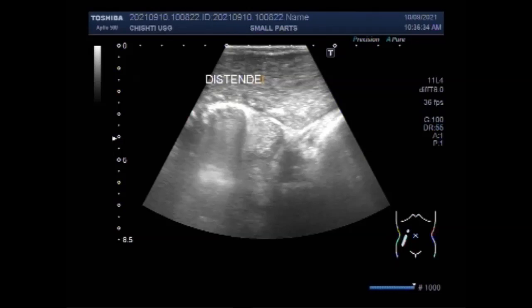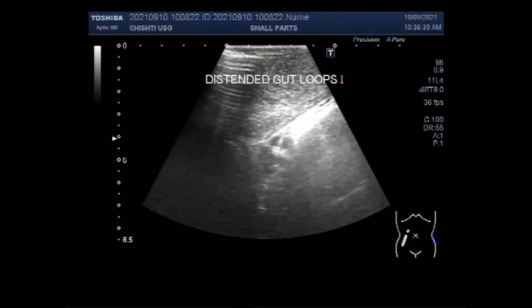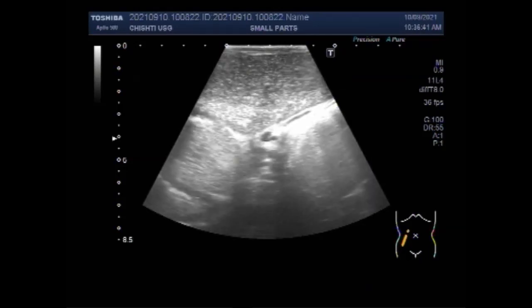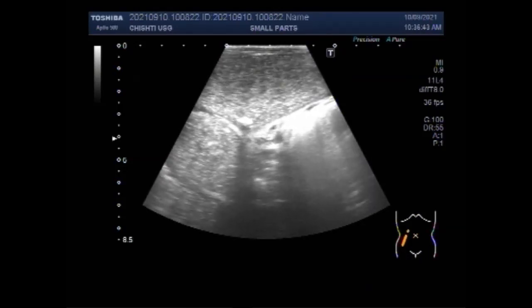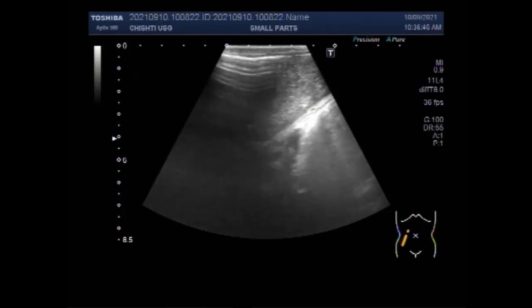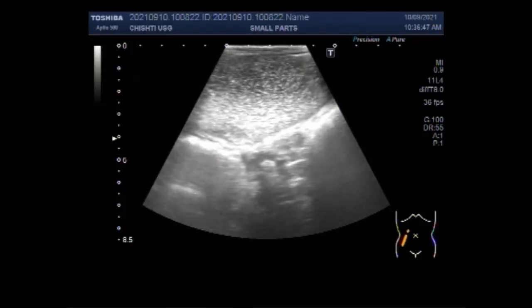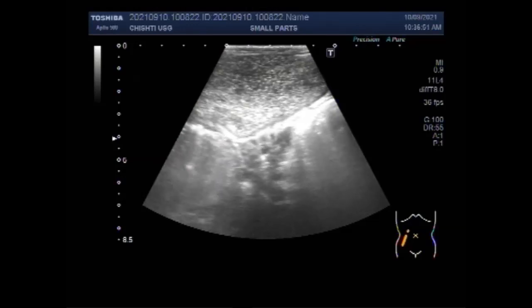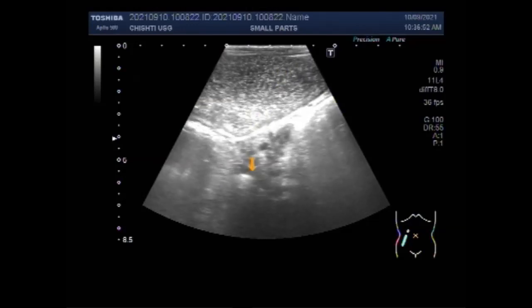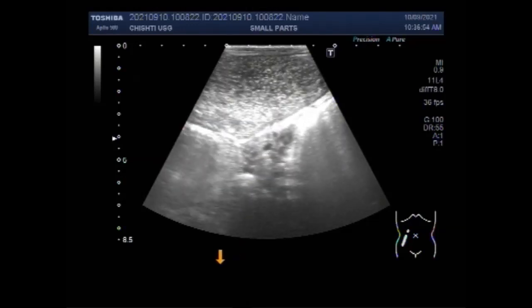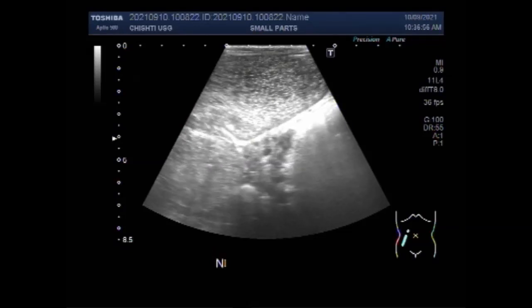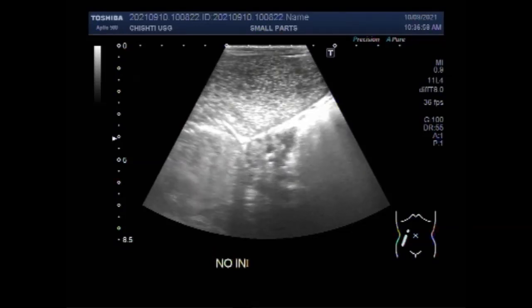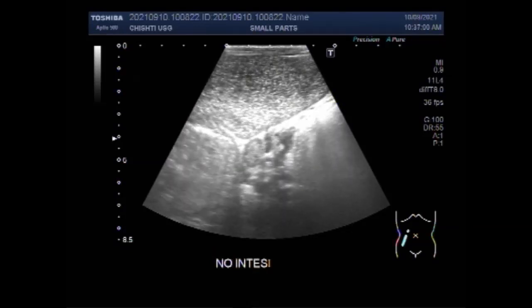You can see the whirling movements — the to-and-fro movements of the intestinal contents within the distended gut loops. The intestinal contents move to and fro because distally there is obstruction. When the intestinal contents are pushed forwards, they come back due to the obstruction.